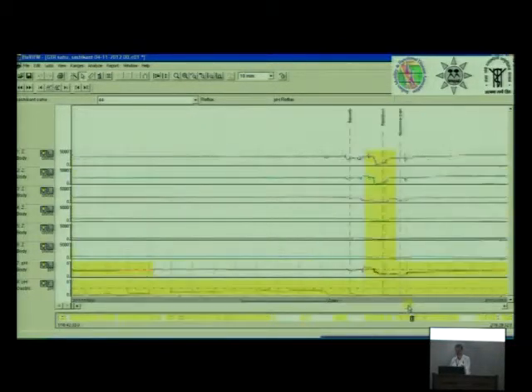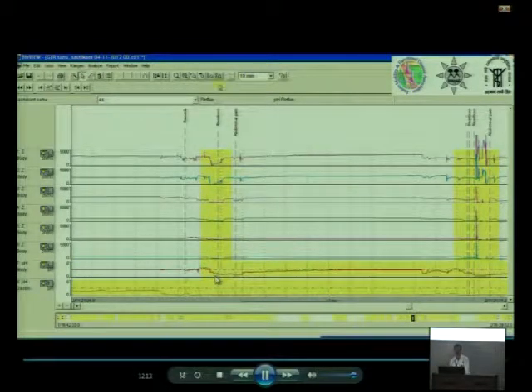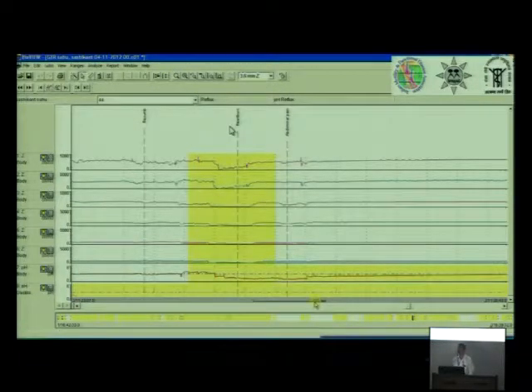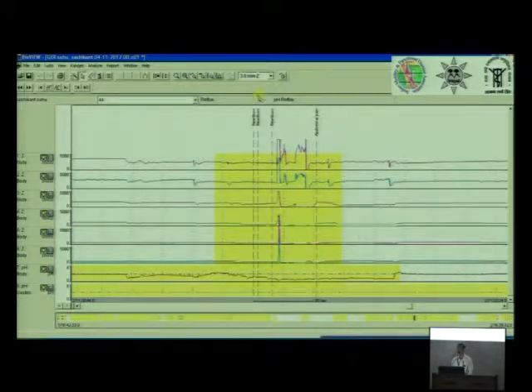So we are scanning the whole record like this. Again, there is a drop in the impedance, there is a drop in pH, and the patient has clicked on heartburn. She also said abdominal pain. You have to understand, this is a major issue. Like this, a patient will tell you abdominal pain, you will say dyspepsia, and he will be given a PPI, but basically there is an acidic reflux.